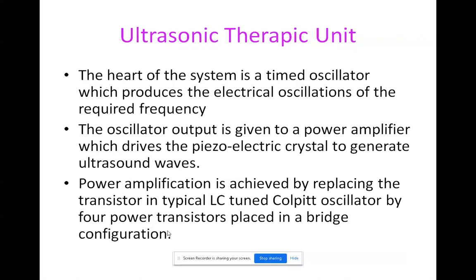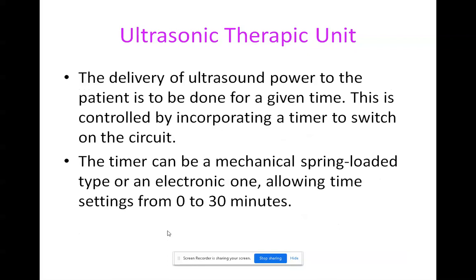So the power amplifier is nothing but you can use a LC tuned Colpitts oscillator with the four power transistors, designed in a bridge manner, which will give you a power amplifier circuit.